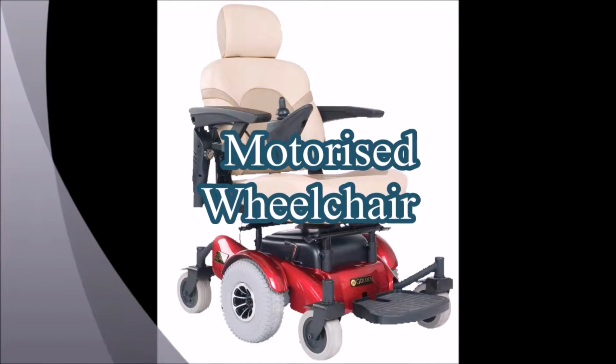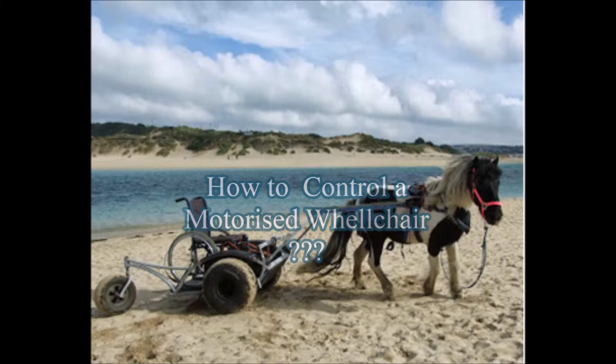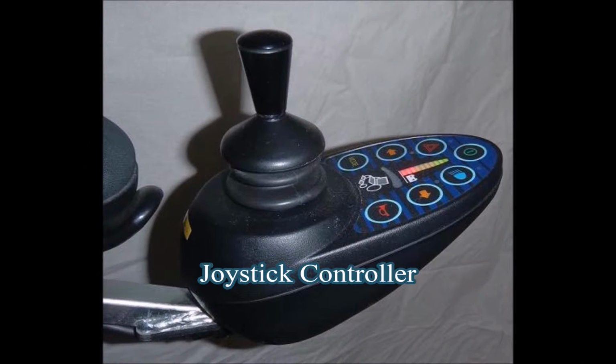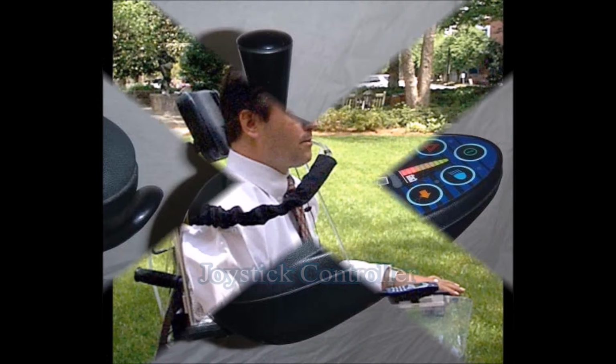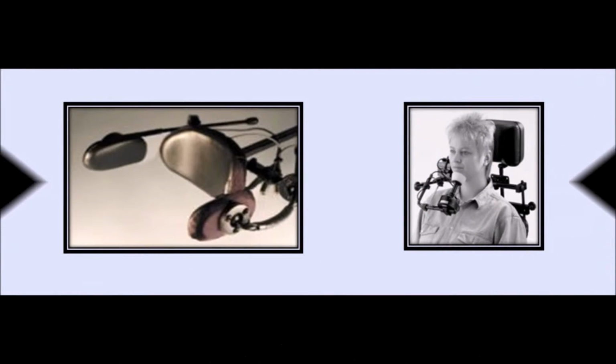To overcome these situations, a motorized wheelchair is used, and a controller is needed in order to move a motorized wheelchair. However, the wheelchair controllers these days are not user-friendly, and are difficult to use. In many cases, a therapist is required to guide the users so that they could move the wheelchair using the controller.